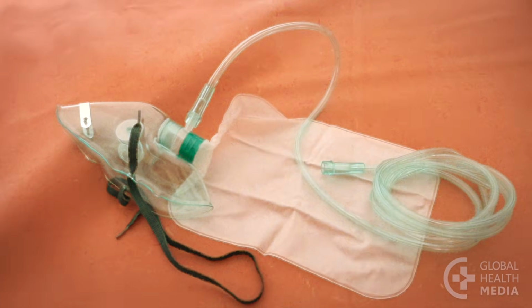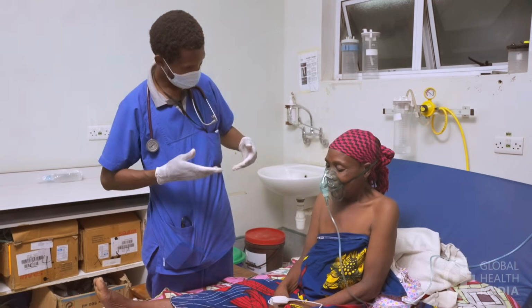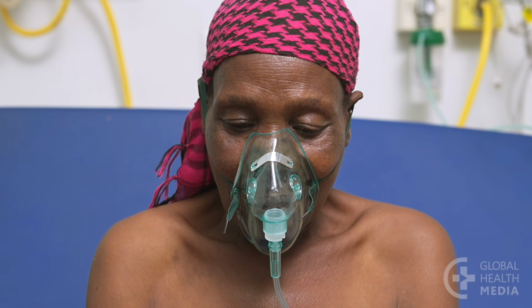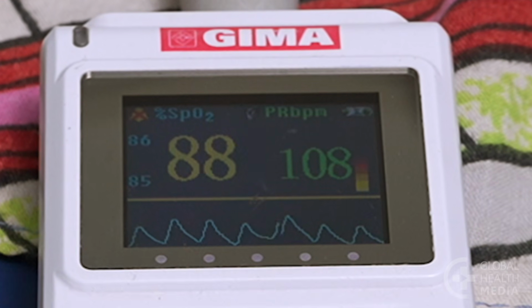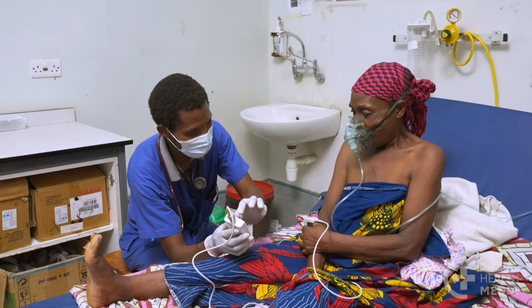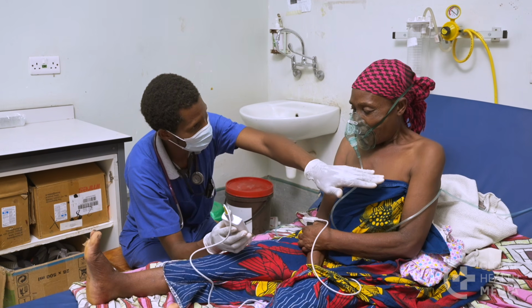The non-rebreather mask. After 5 minutes on the face mask, if her breathing has not improved or the oxygen level is still less than 92%, use a non-rebreather mask. Discuss with the patient what you need to do and why.